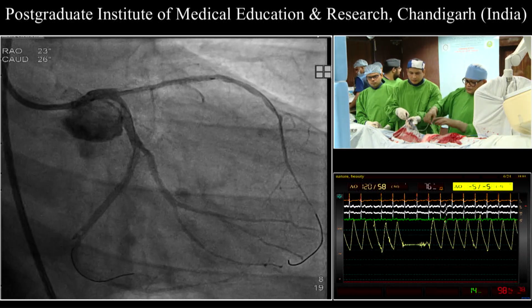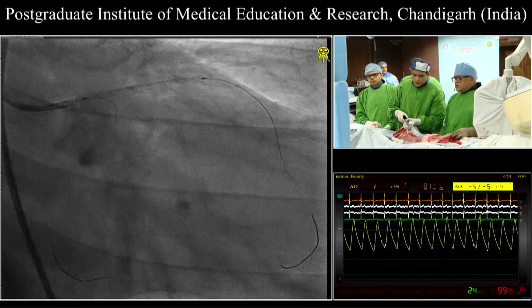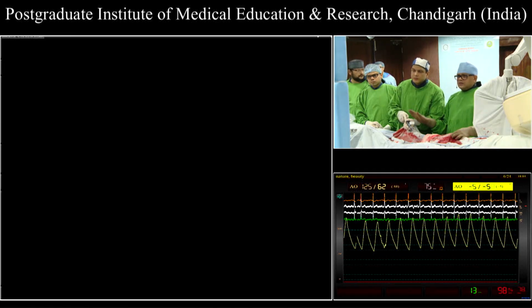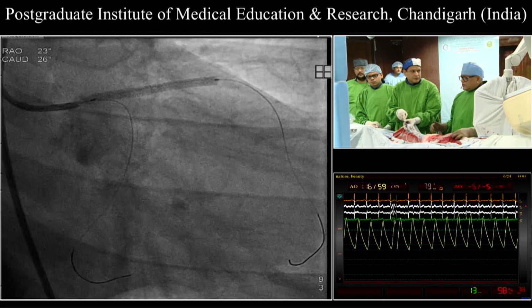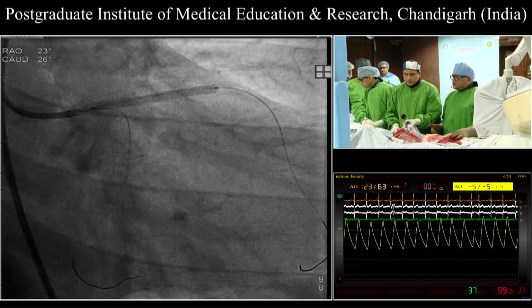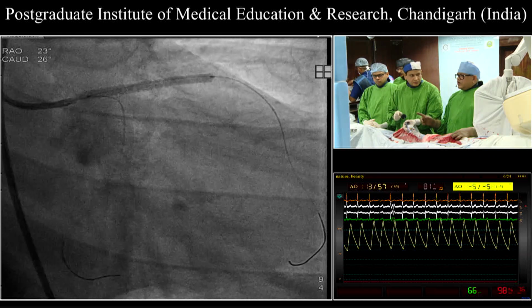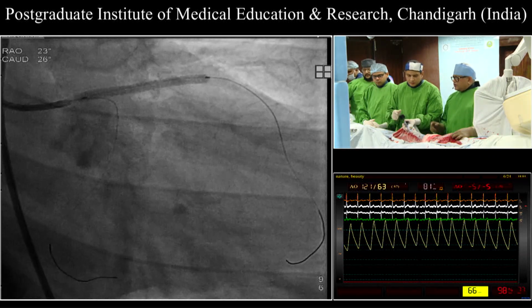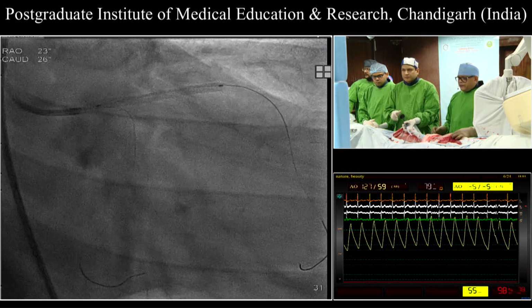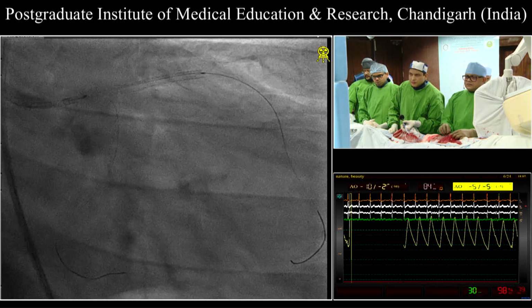The question from the audience is, if you intend to expand the stent proximally to 4.5 with a 4.5 balloon, and you're using the Expedition platform, is that correct? Or is it Sierra? No, it's an Expedition. Expand to about 4.6, 4.7? It's an Expedition 3.0 platform, so you need to look at 4.3. That's enough with 4.3, because if the vessel is larger than 4.3, the stent will be too small in the vessel.